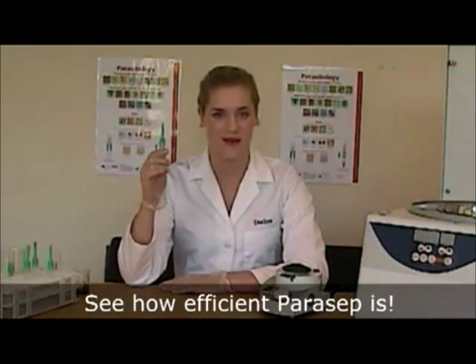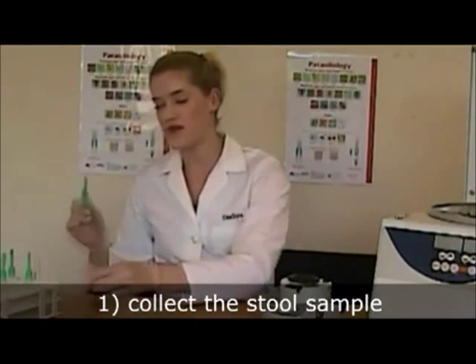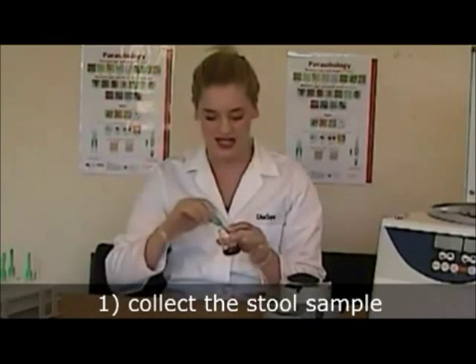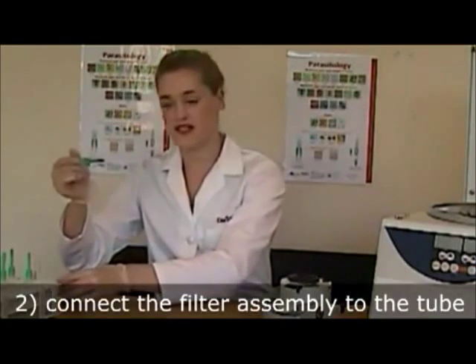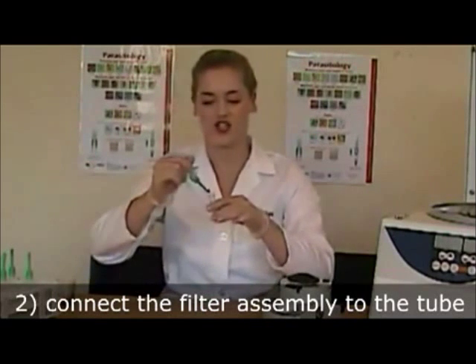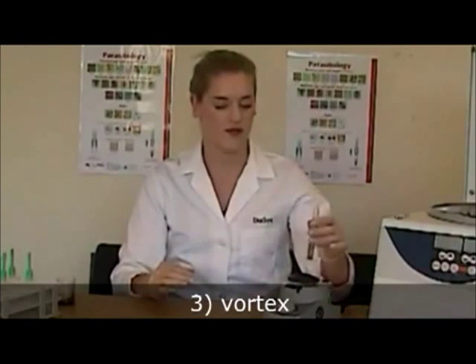Let me show you how efficient the Paracep is. Collect a level scoop of the stool sample with the sedimentation tube and the filter connected. Connect the filter assembly to the reagent containing tube and close tightly. Vortex the assembly until the feces is emulsified.